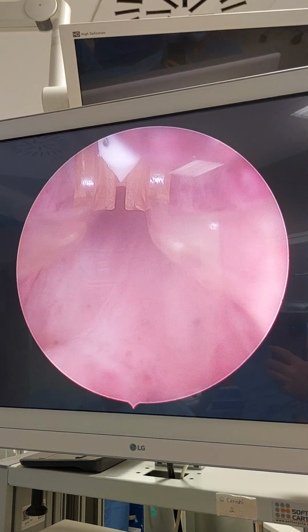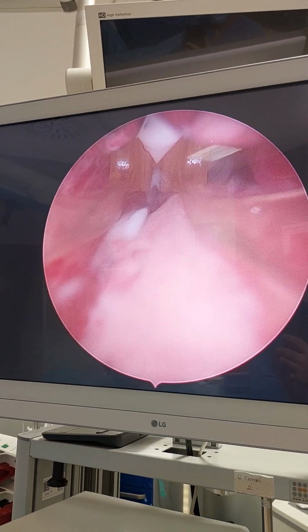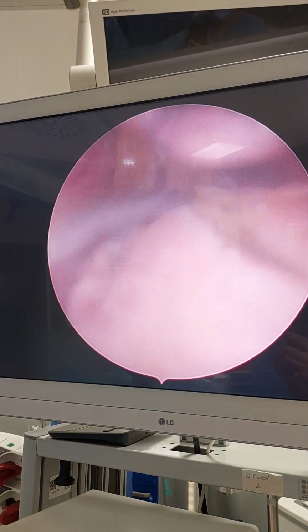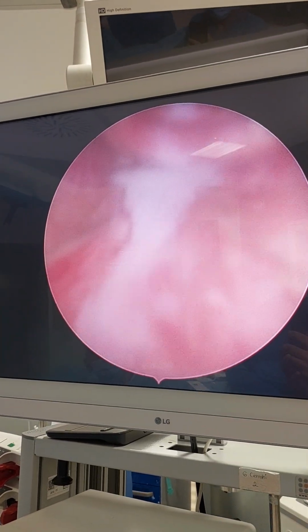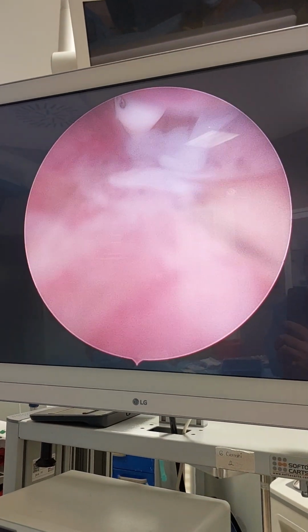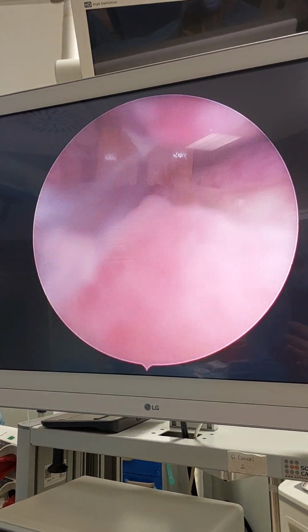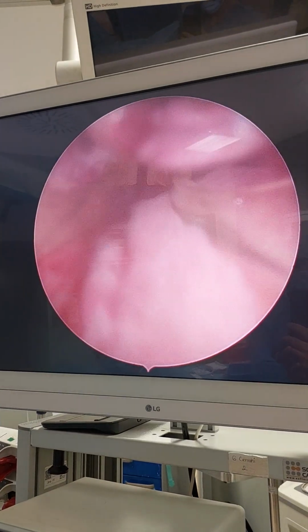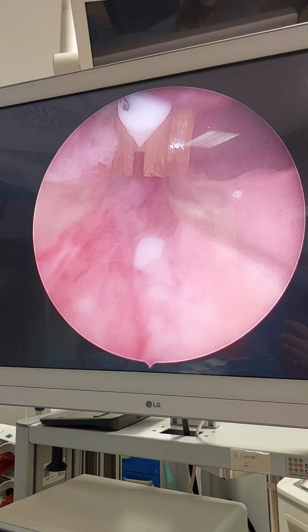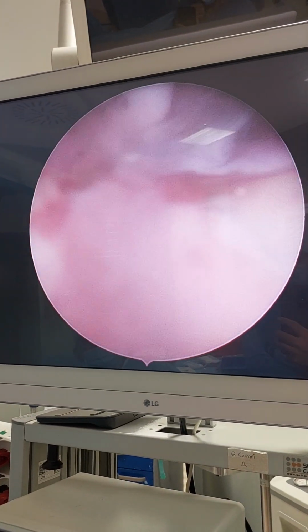Yeah, it's really tiring. But I don't want to leave too much infection behind. Look at this side. When I drain it, it begins to come more and more. So I want to be really patient and finish it completely. Look at this. I don't want to do the Rezum with this inflammation inside the prostate.